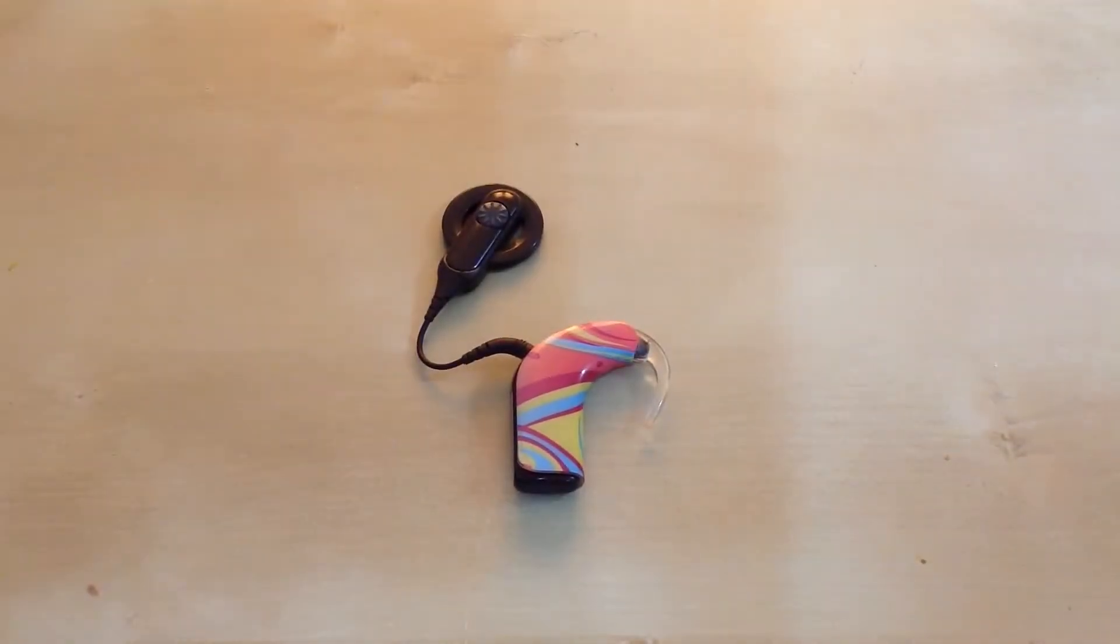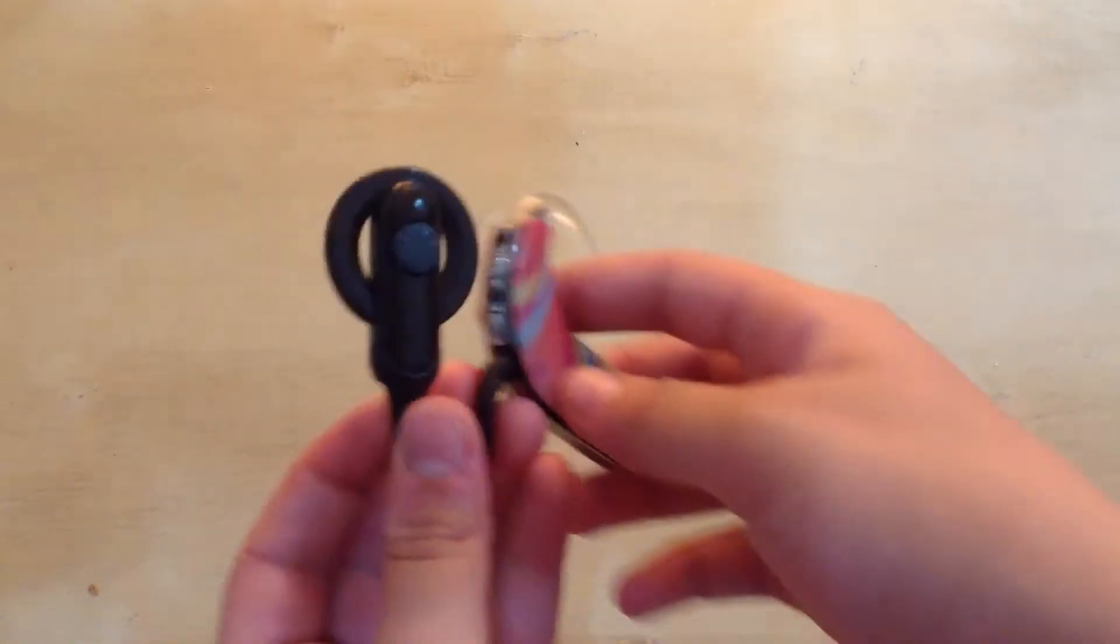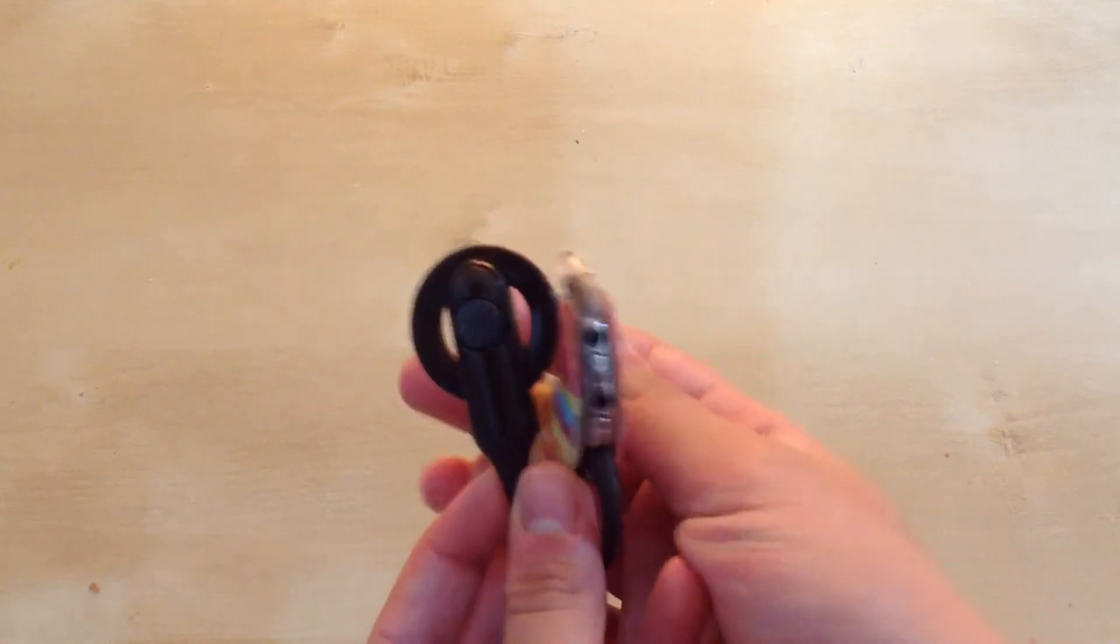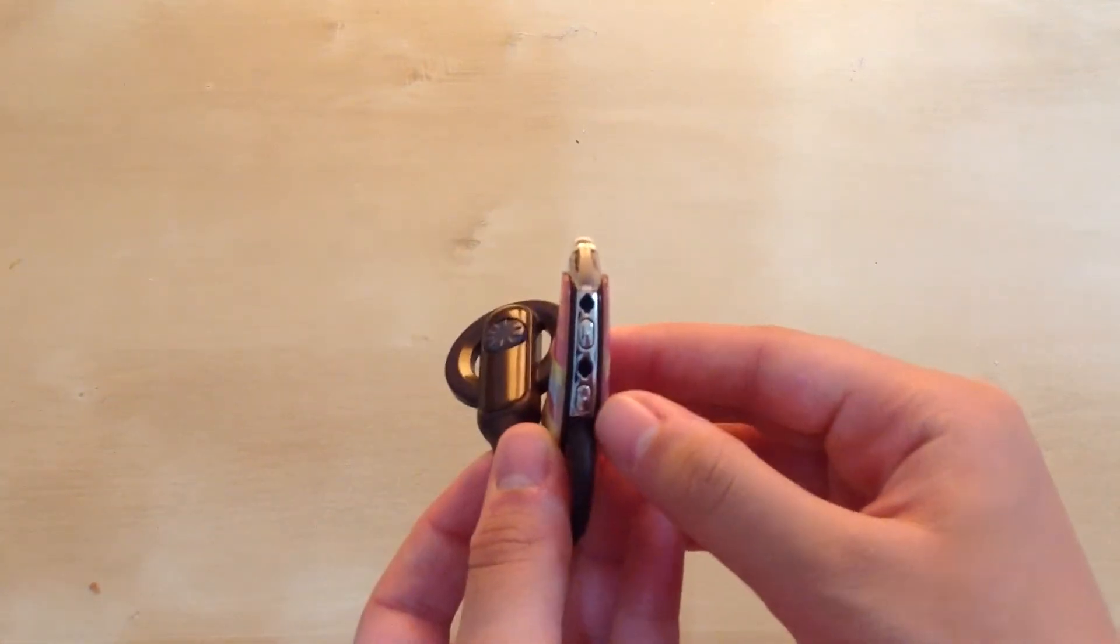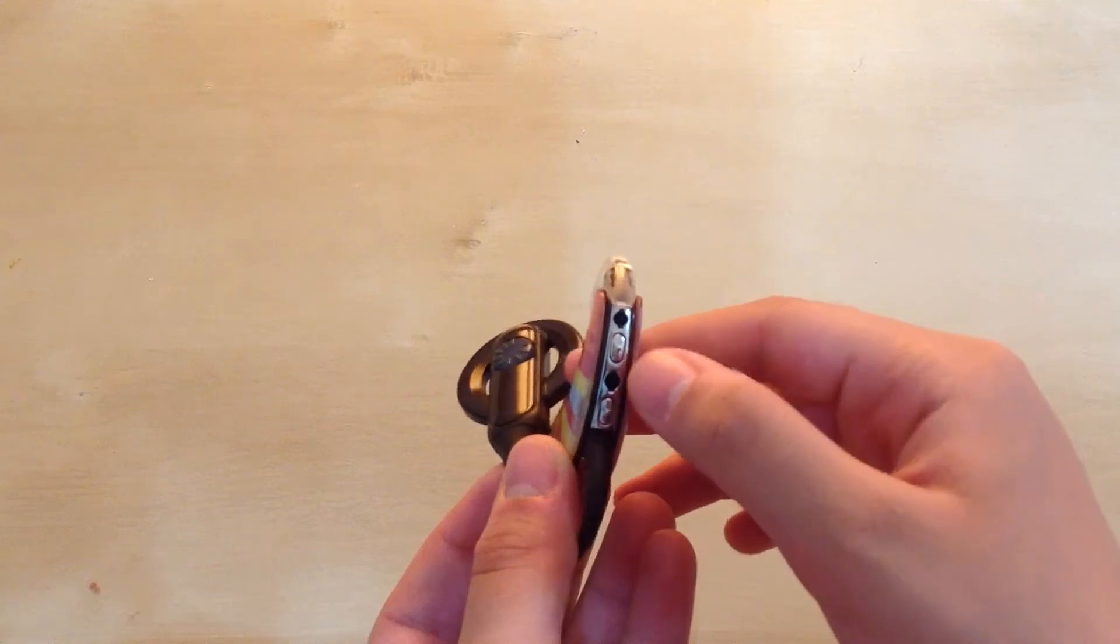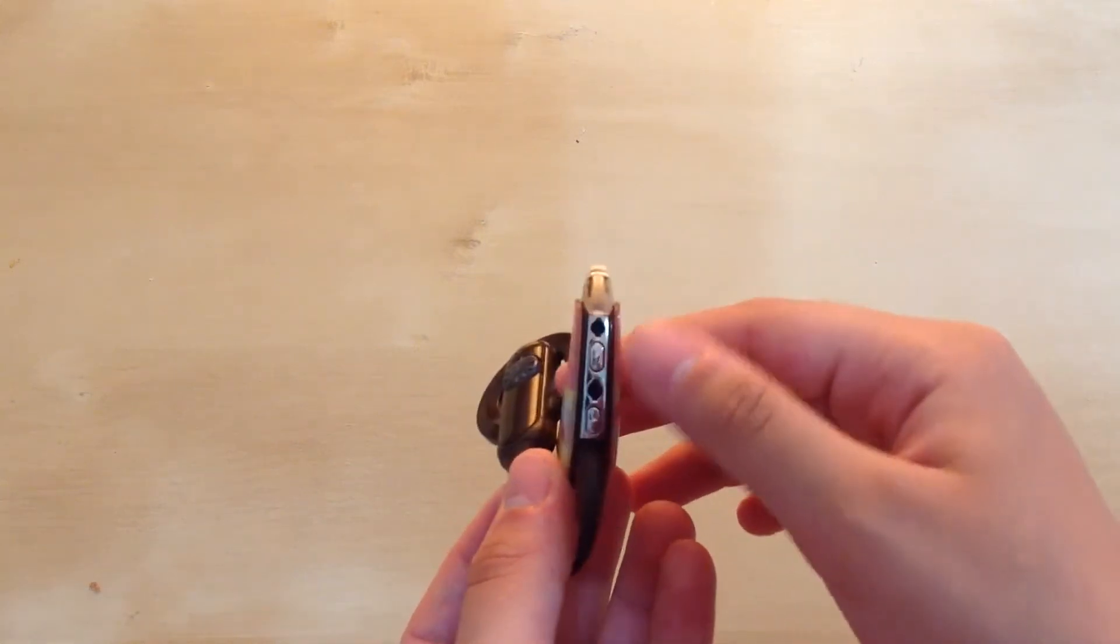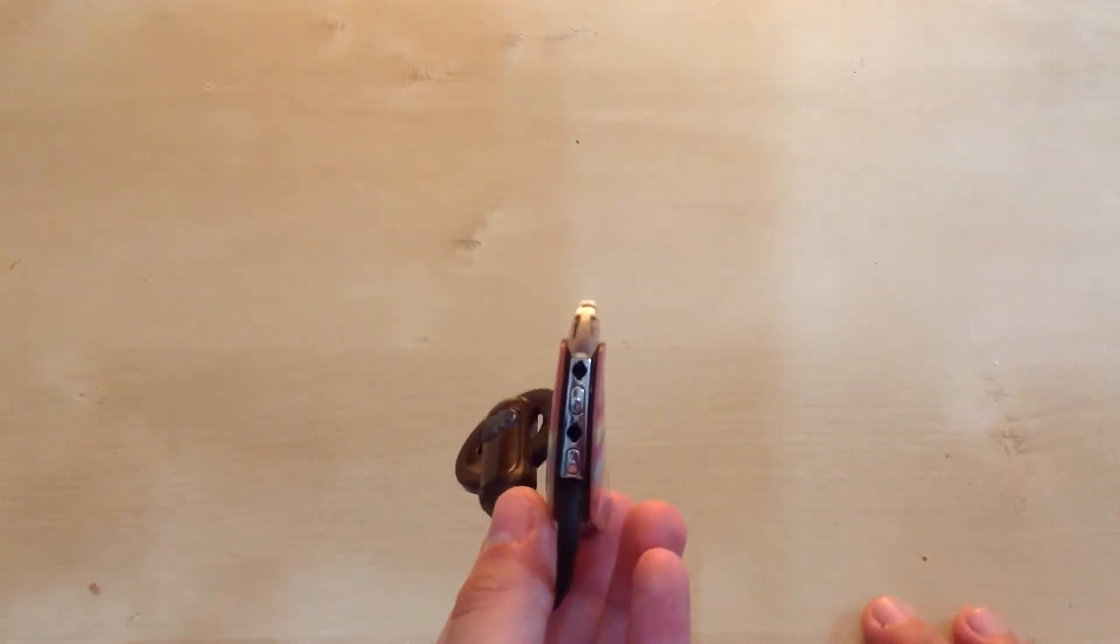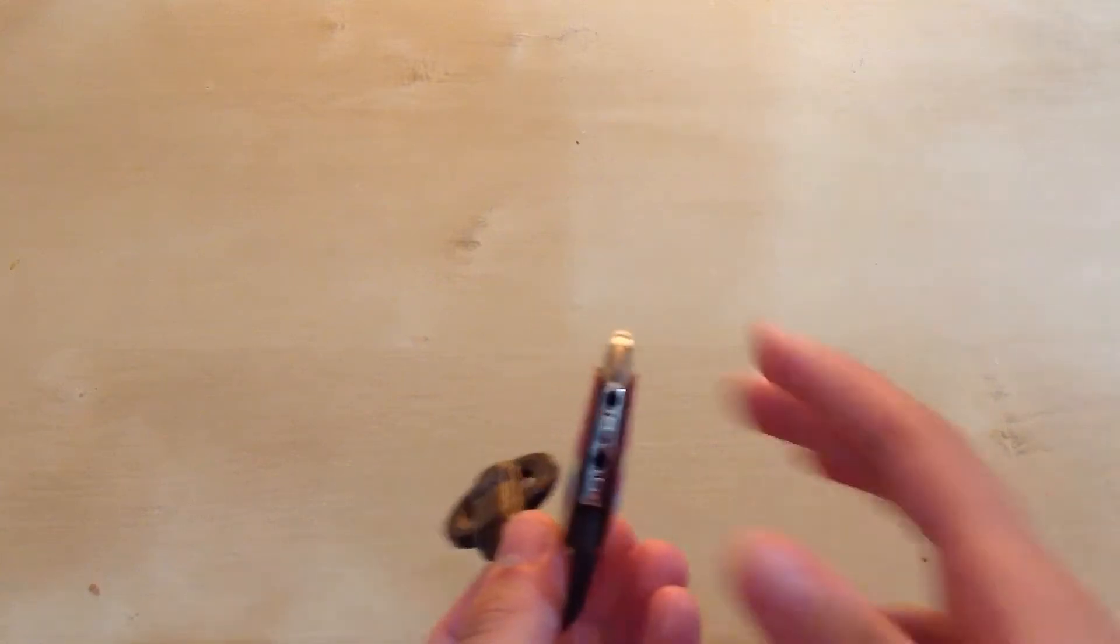So this is the Nucleus 5 cochlear implant right here. As you can see, on the top there are two buttons right here, the silver ones. Those are the buttons. The black dots you see right there are filters, and that's where the sound goes in.